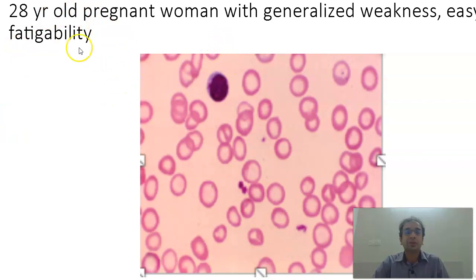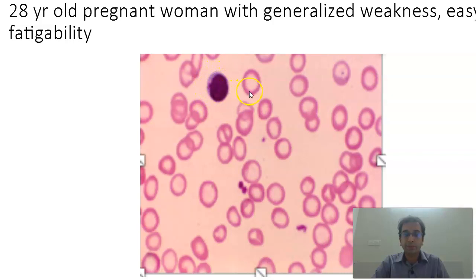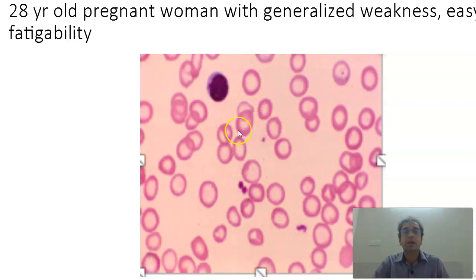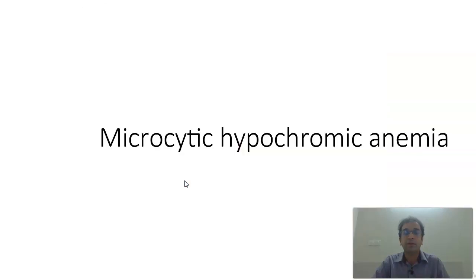Coming to hematology slides: a 28-year-old pregnant woman with generalized weakness and easy fatigability. For reference, the small lymphocyte is the ruler. You have to compare the RBC size with that of the small lymphocyte. You find the RBC is smaller than the small lymphocyte — it is microcytic. There is hypochromia because normal red blood cells should have one-third central pallor; here the central pallor is more than one-third. This is a microcytic hypochromic anemia.